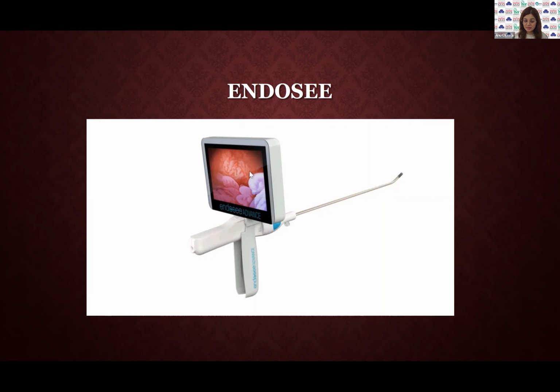So it's very easy. It can actually change the practice, meaning decrease the cost to the patient because it's a simple procedure, doesn't need the anesthesia, doesn't need to be going into the operation theater, and it can be used at least to begin with even before going into the operation room, or at least as a diagnosis, especially in unexplained cases. For example, we all see that for years and years the patients are thinking that their case is unexplained infertility, and they're doing acupuncture and all sorts of other help.